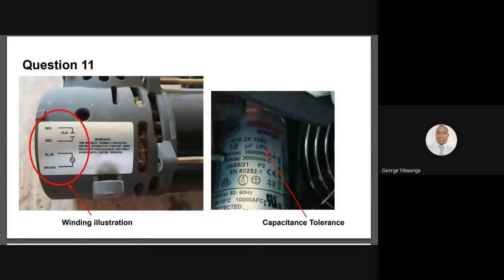Yes. So as you can see in the picture on the screen, the label on the capacitor shows that the capacitor is supposed to be in the range of plus or minus 5%. So I would not advise using that 15 microfarad capacitor in place of the 10; you're supposed to get something that is within plus or minus 5%. Thank you. Thank you, George.